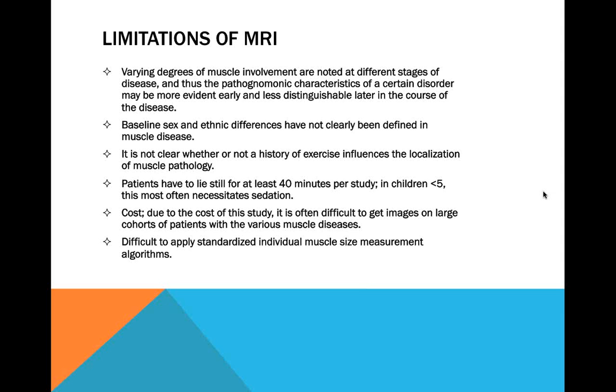So it's made it really, really difficult to get volume assessments, and also volume assessments in particular, meaning checking the volume of the muscle from top to bottom. But cross-sectional areas can typically be done relatively easily by tracing it by hand. Right now, if you want to get a muscle assessment, a volume assessment, which is being done by one of my colleagues here at the NIH, she actually had to hire people to do cross-sections at each slice and basically add them all up together to come up with the volume. So you can imagine how time-intensive and tedious that is. But there are people who do it, and they do charge for it.